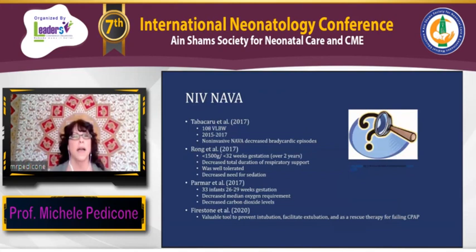A few studies out there. Tabakaru and his group in 2017, with 108 very low birth weight babies over 2 years, found that non-invasive NAVA decreased bradycardic episodes. Wrong and his group in 2017, over 2 years, again with some preemies, found that NAVA decreased the total duration of respiratory support needed. It was well tolerated, and it decreased the need for sedation.